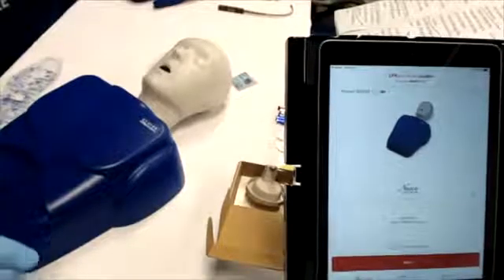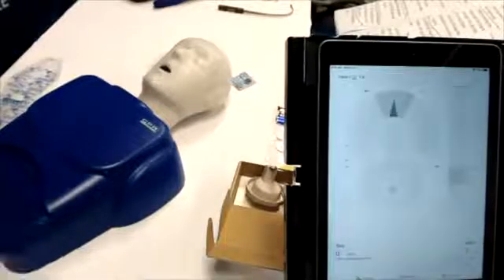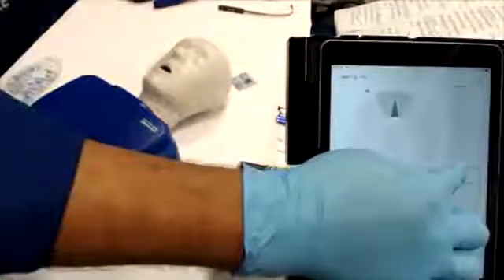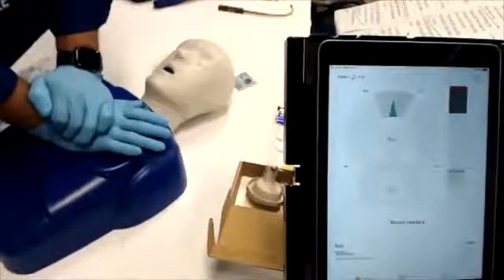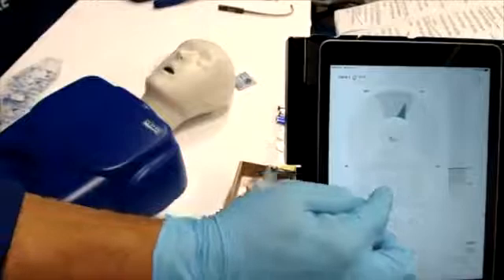Now we're going to show you how the screen will look. In the upper right-hand corner, the student can tap to hear the metronome or mute. Compressions display with the speedometer on the left over the mannequin image. Hand placement indicator is on the mannequin image.